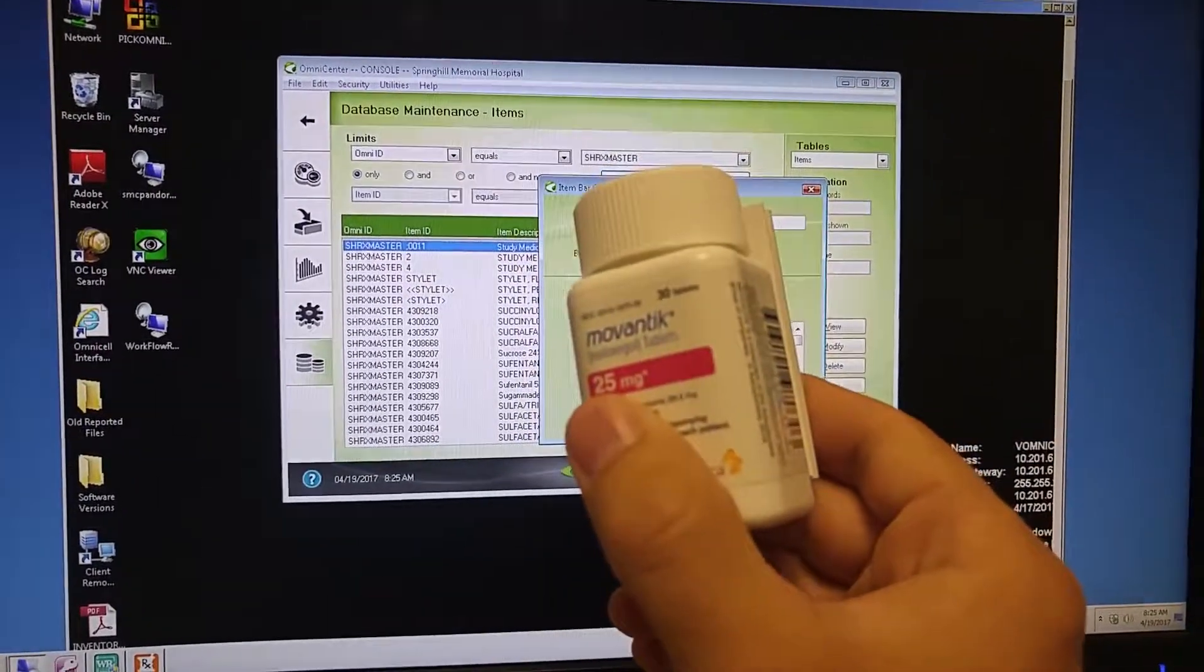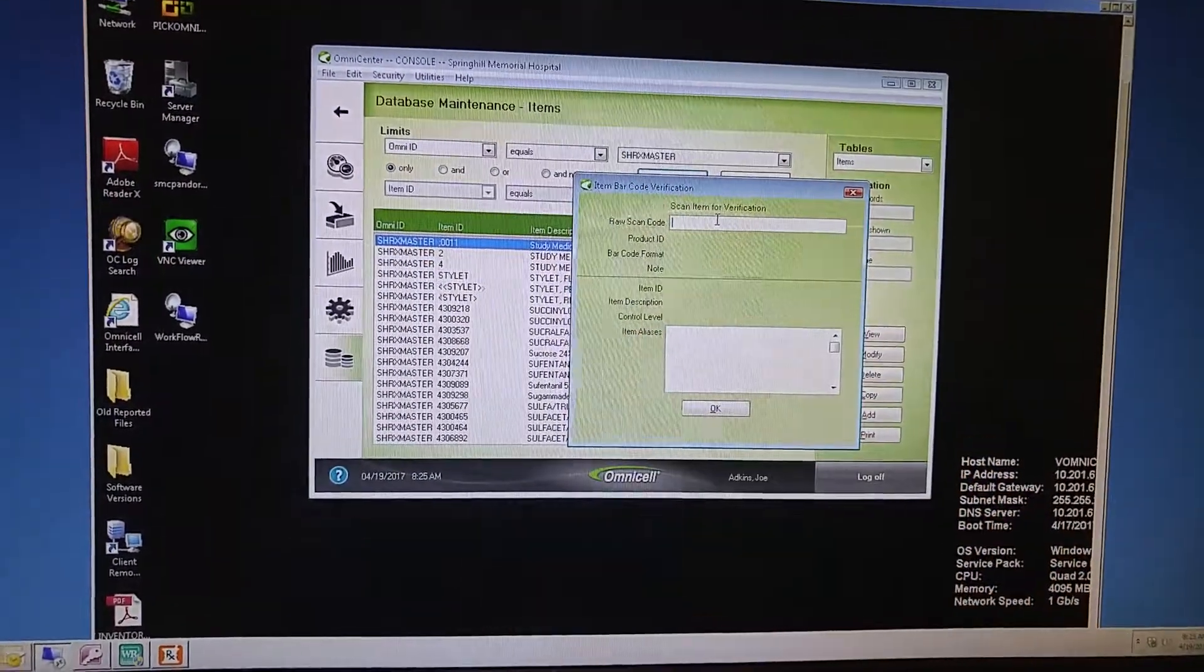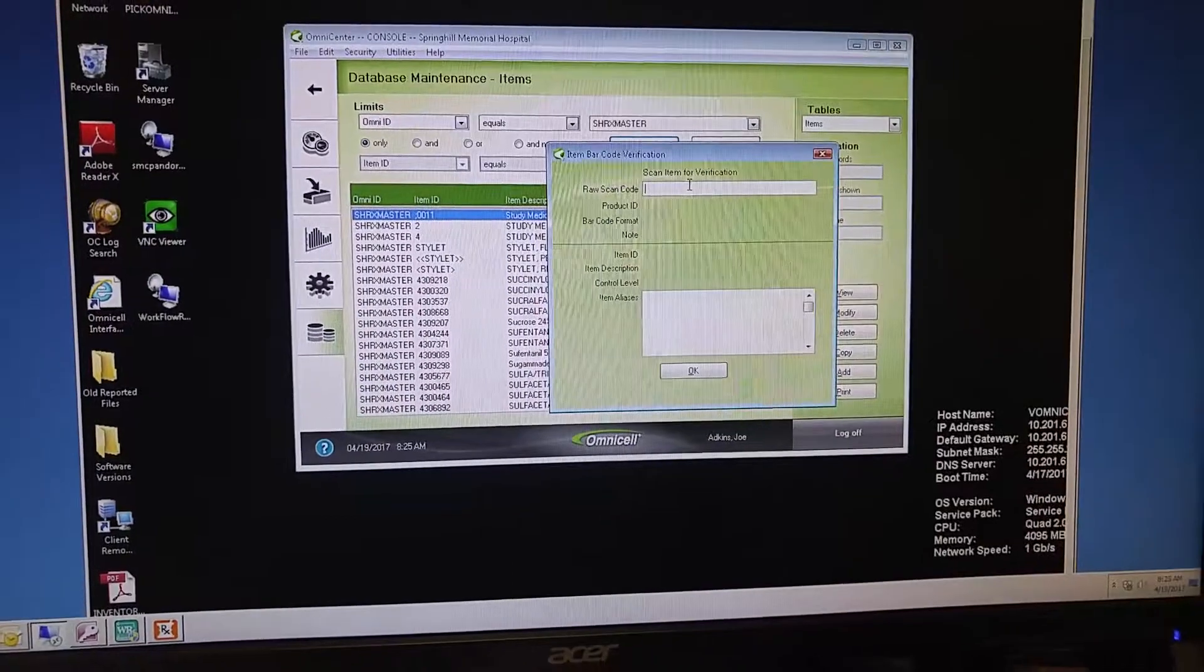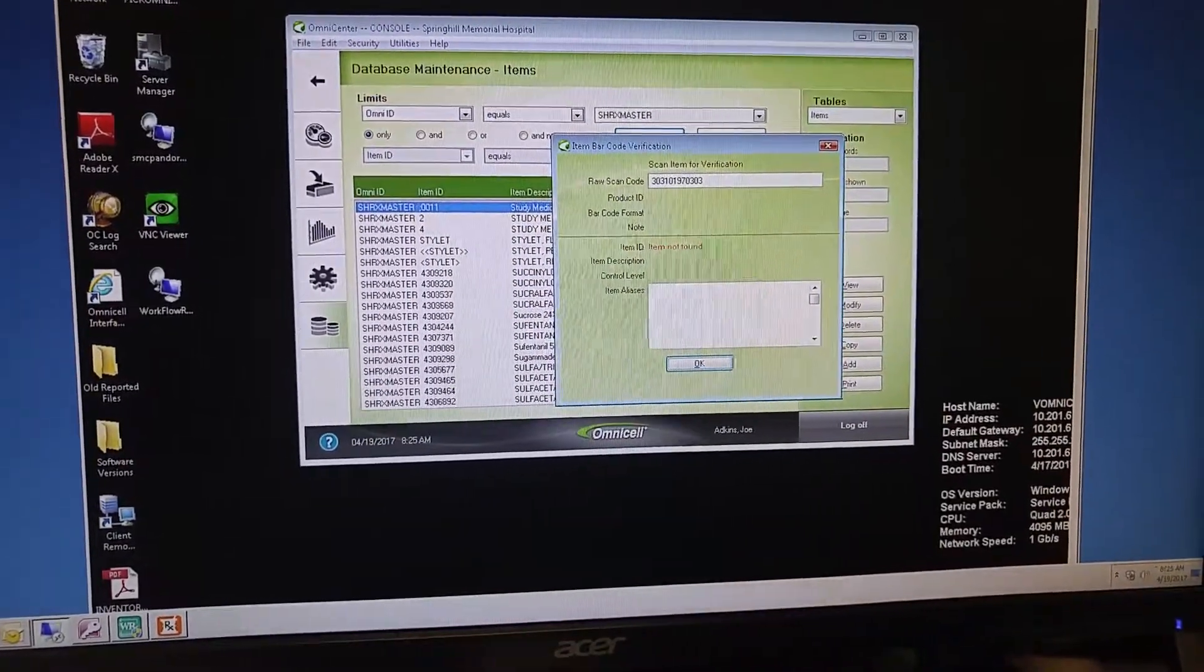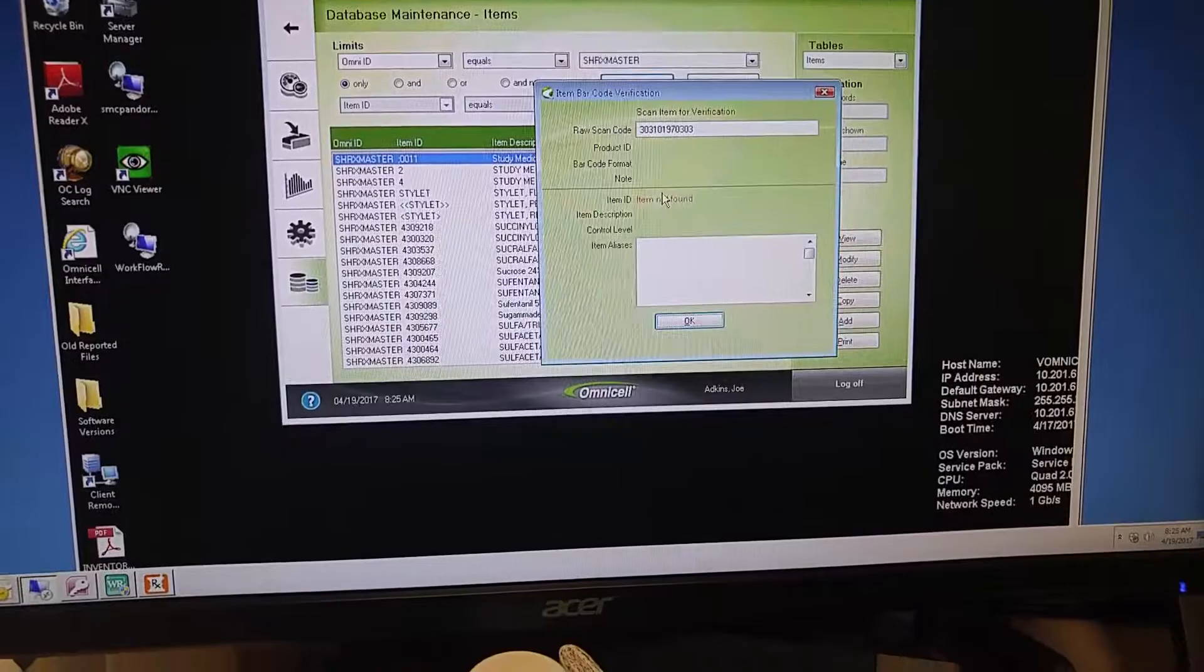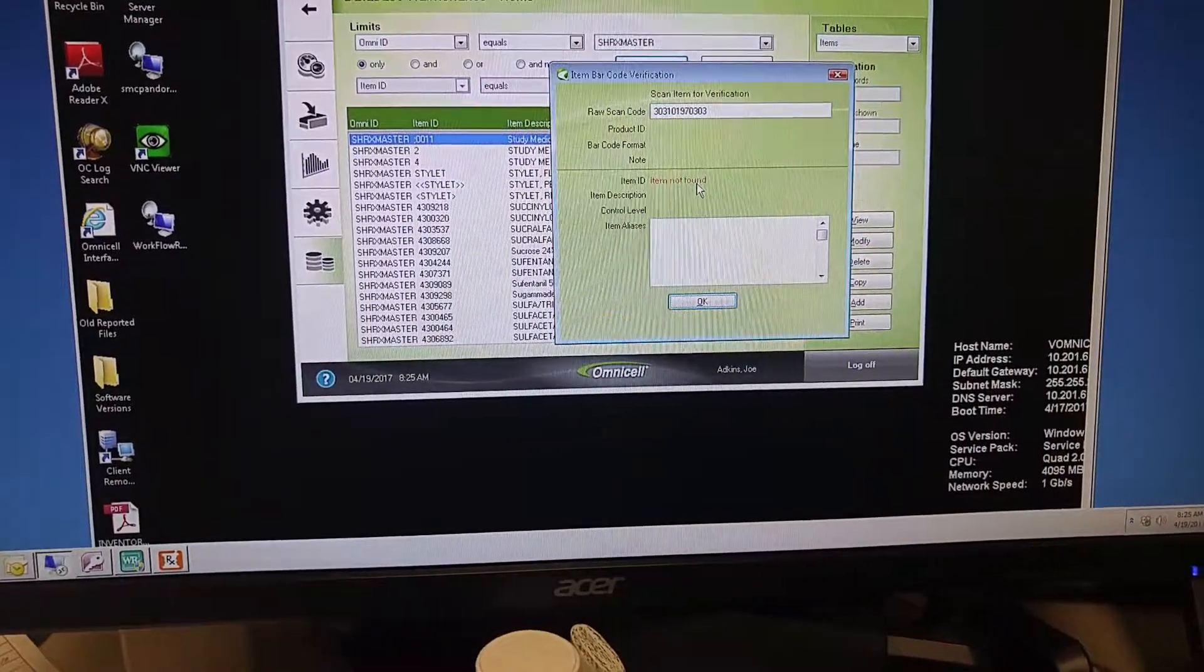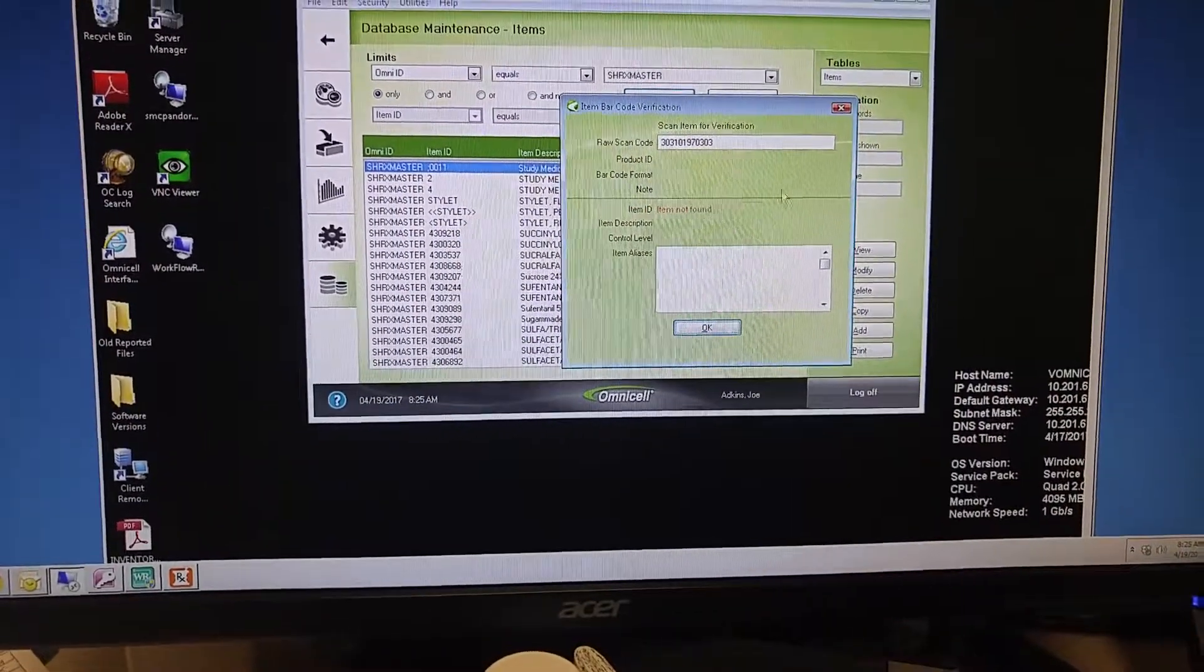In this case, we are going to scan Movantik, a new barcoded product. So I will scan that, and we'll see that item is not found, which tells us that we do need to add the barcode to this product.